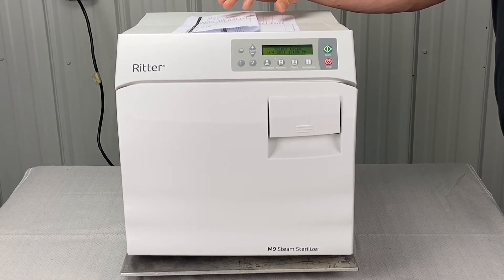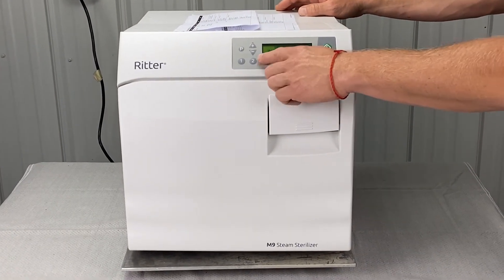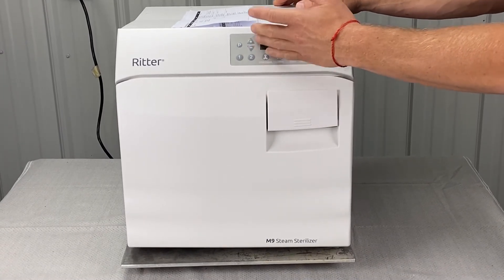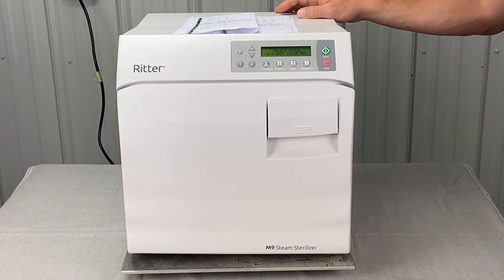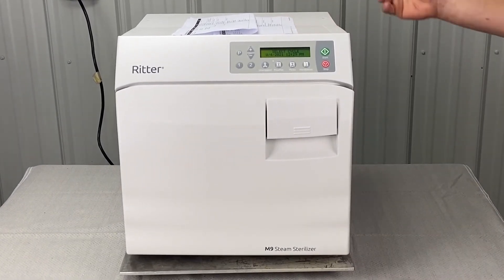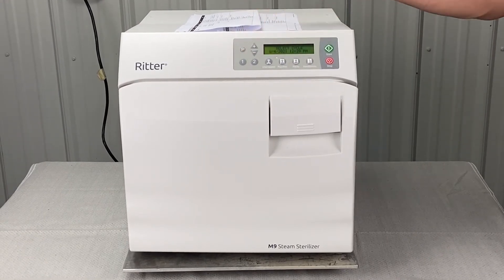Verify the unit is operating within designated program parameters. If you're adjusting these parameters, there's only so far you can go one way or the other, and it's on a case-by-case basis. I would call and talk to a technician before you start putting these presets way out of whack.